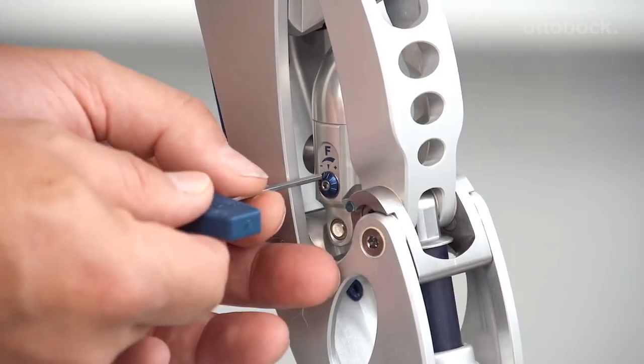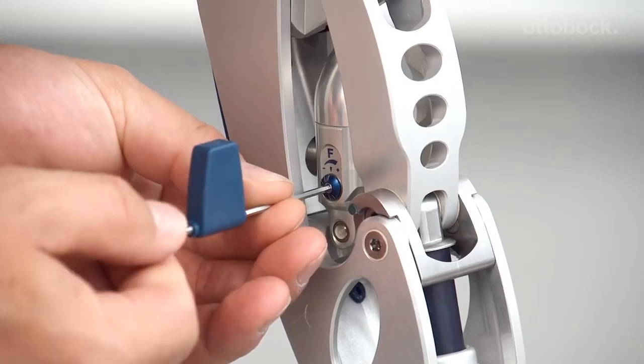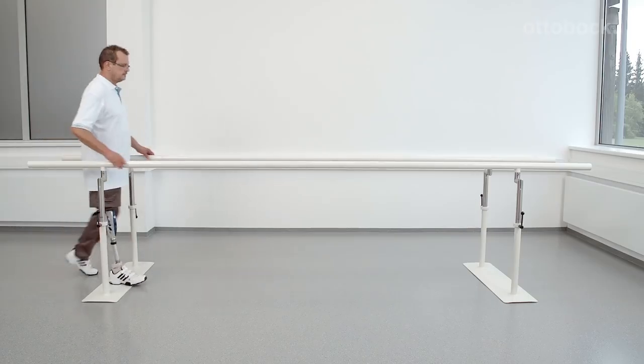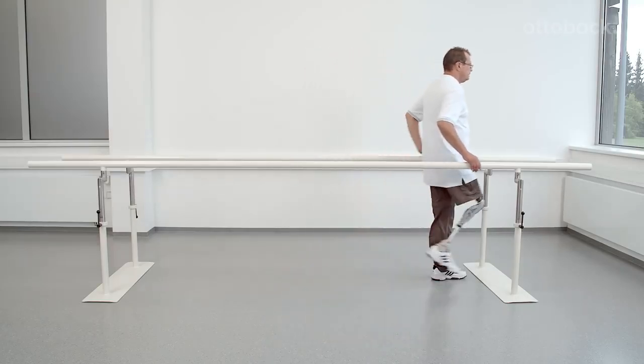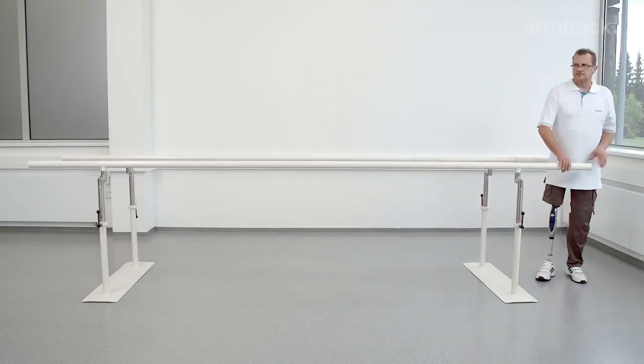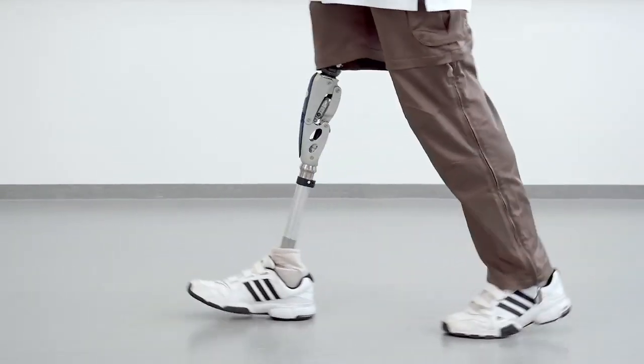The following video sequence will demonstrate how the knee joint reacts at the extreme setting of the swing phase damping. First, the knee joint is shown with the flexion damping set at the minimum. At higher walking speeds, the user has to wait too long for the prosthesis to reach full extension at heel strike.